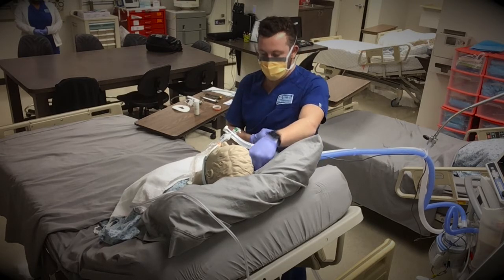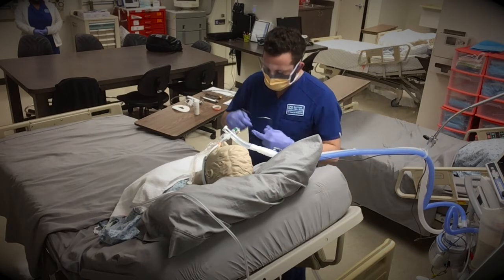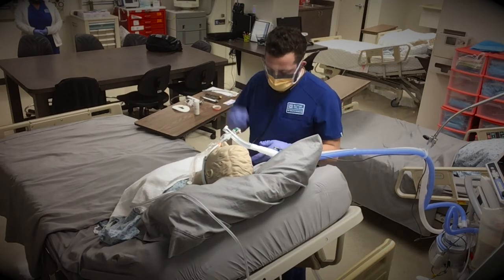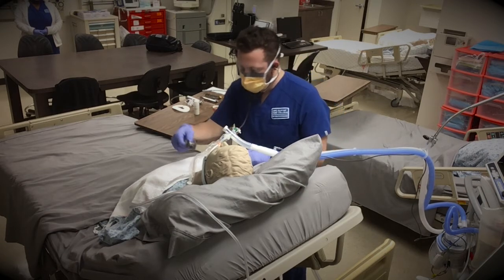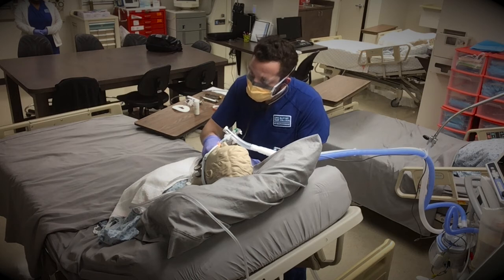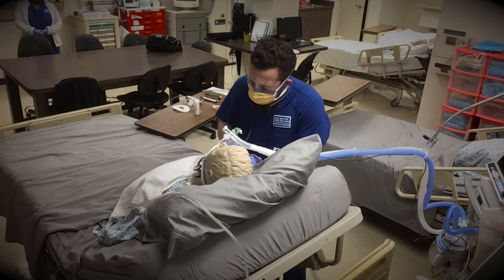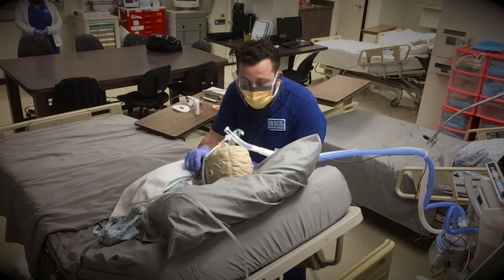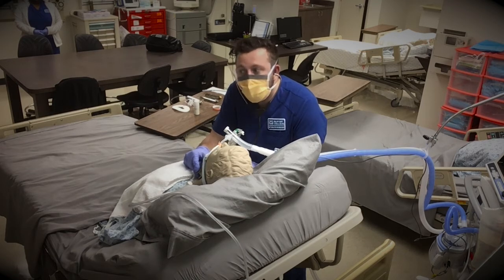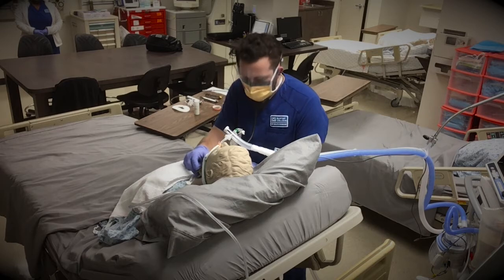So we've got the 10 ml syringe, and we would just take a stethoscope and place it on the side, and we're listening for that audible leak around the tube. If no audible leak is present, the RT should reinflate the cuff and discuss with the physician how to proceed.